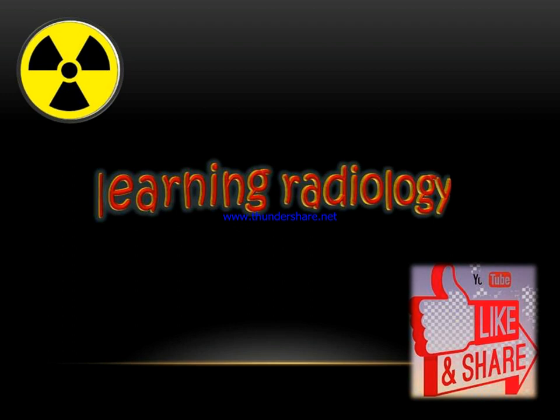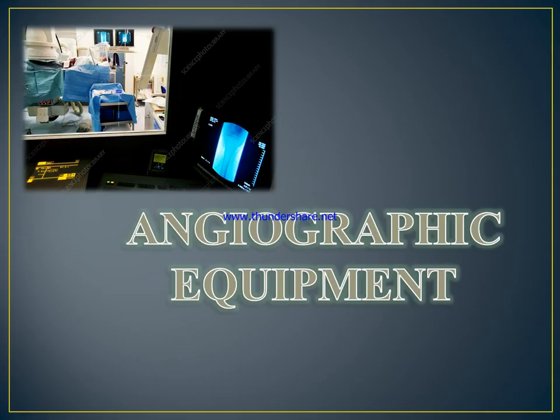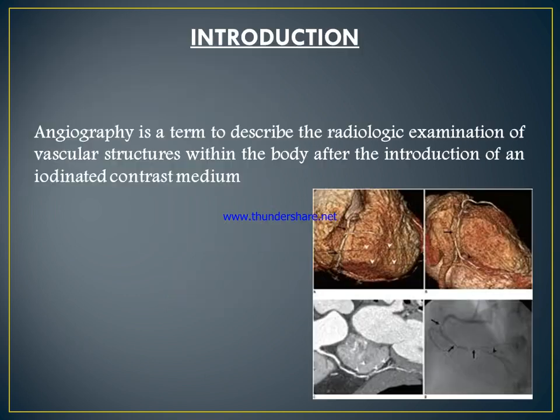Then we start our topic. Today we will discuss the topic angiographic equipment. In angiography we use many types of equipment to perform the procedure. Angiography is a term which describes the radiological examination of vascular structures within the body after introduction of a contrast media.